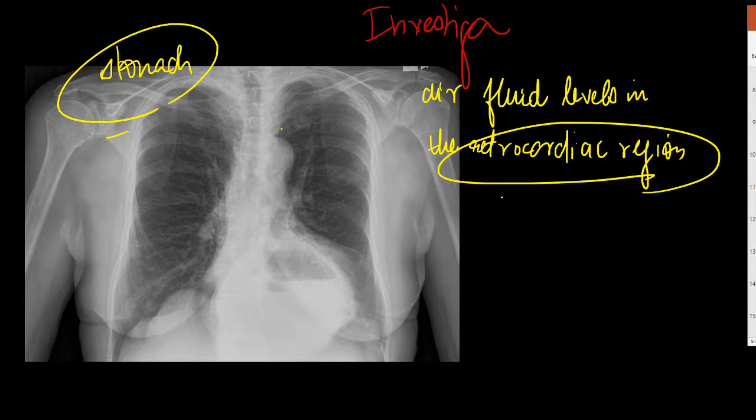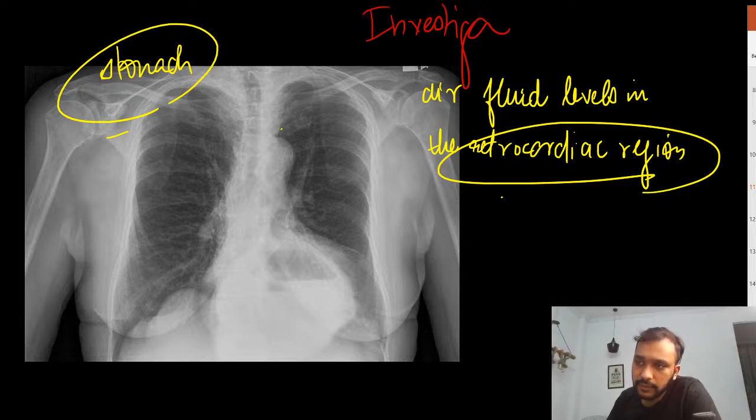Come on guys, what is your characteristic finding in hiatal hernia? You are not writing down air fluid level. Everyone should write it down. Air fluid level. Where are you going to get this air fluid level?